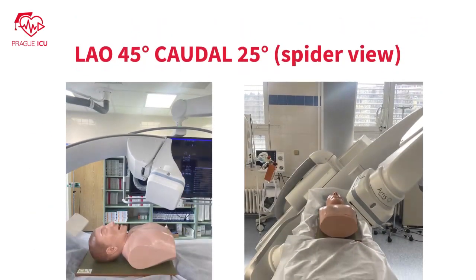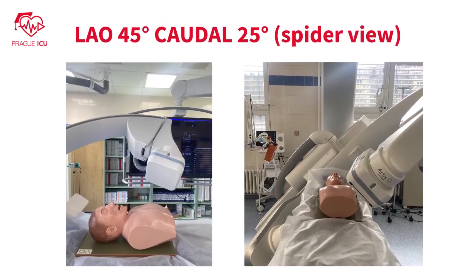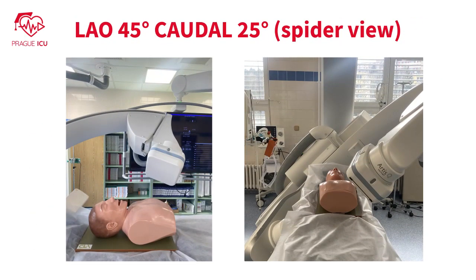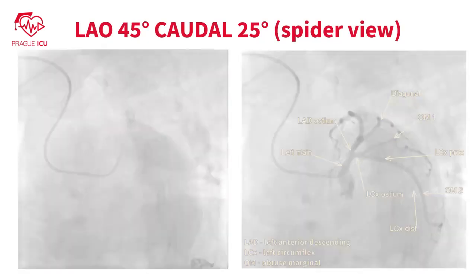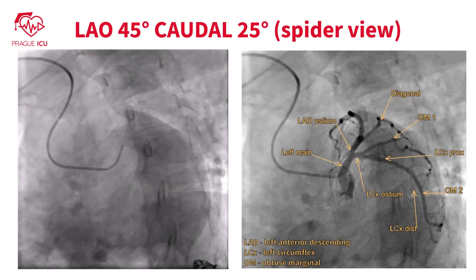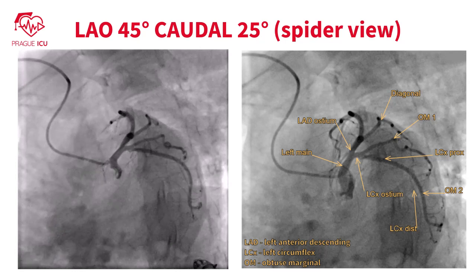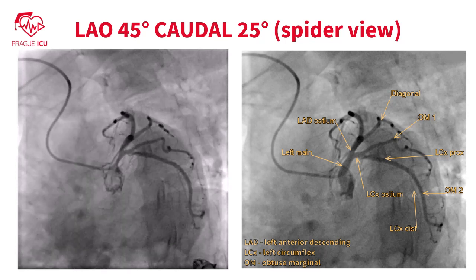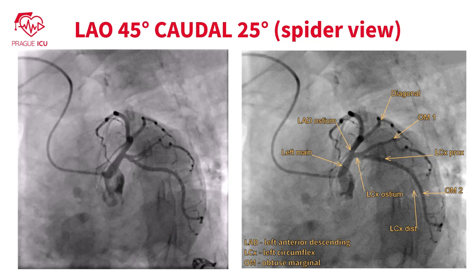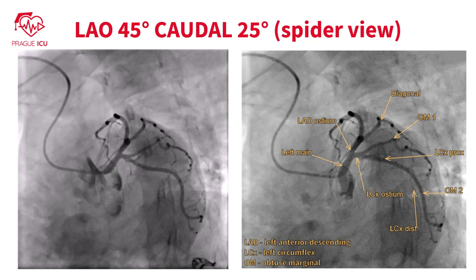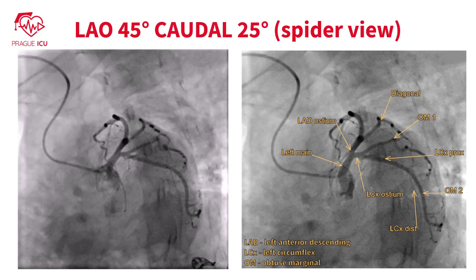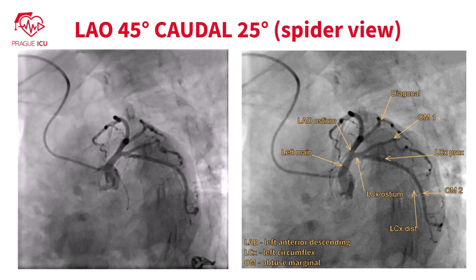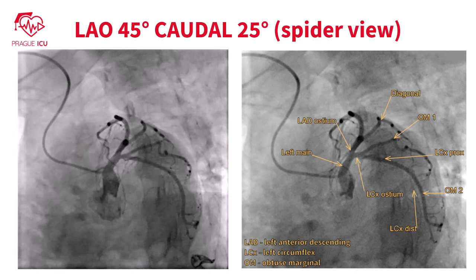Left anterior oblique 45 degrees, caudal 25 degrees view — the so-called spider view — is often the first view taken during diagnostic coronary angiography. It has the advantage of visualizing the proximal left anterior descending artery and left circumflex artery, along with the distal part of the left main coronary artery.